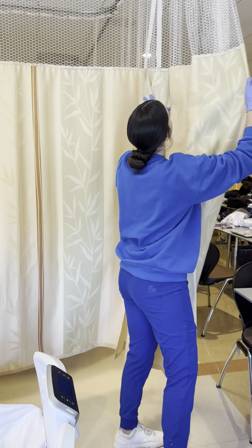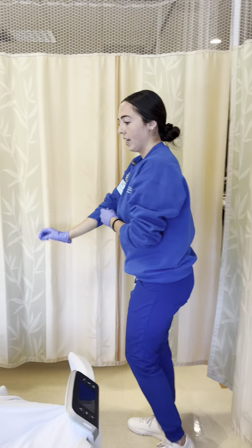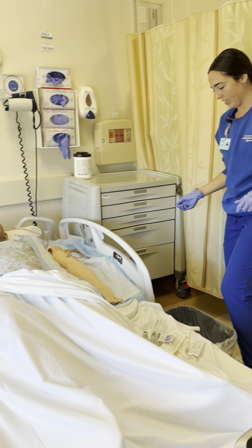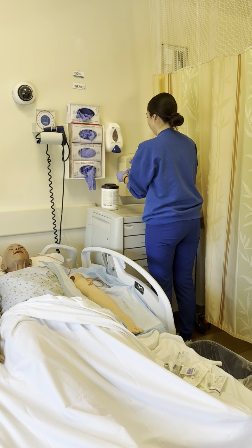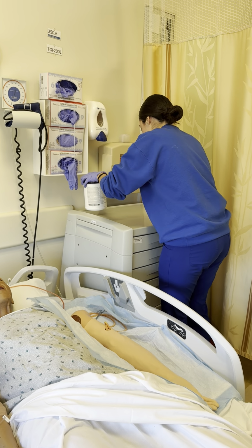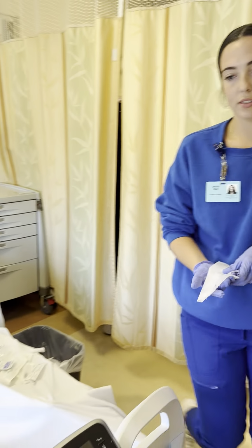Next, I'm going to make sure my trash can is where I want it. I'm going to wipe down my surface over here, and over here as well.